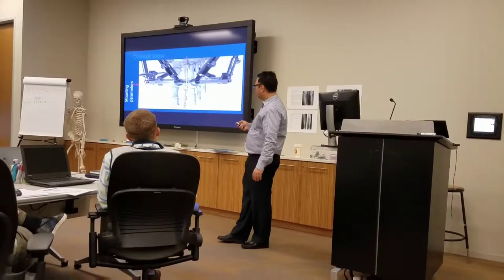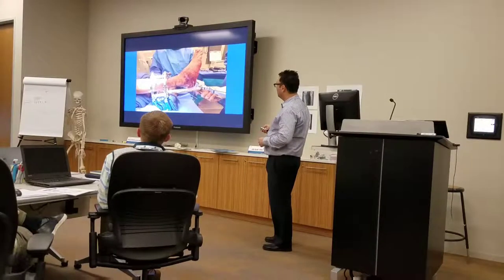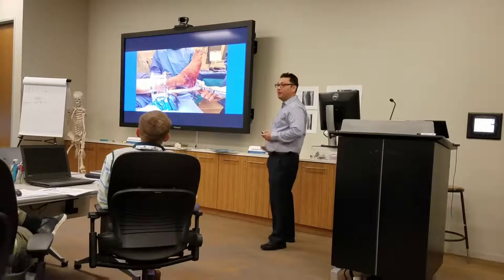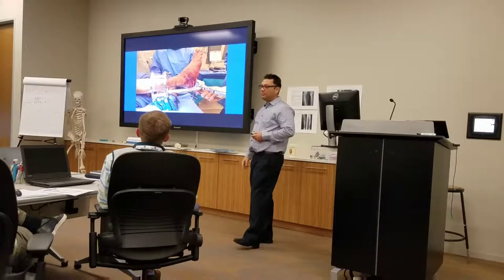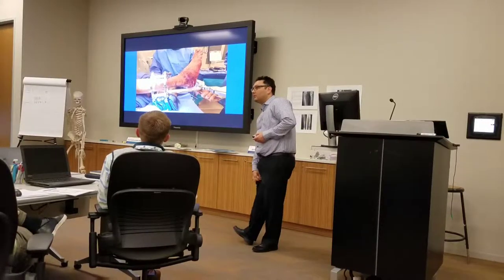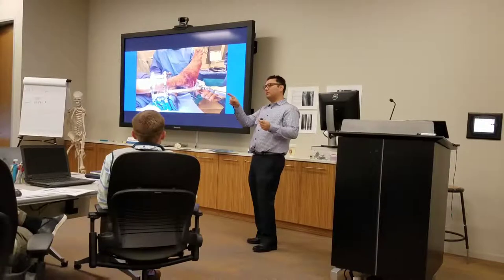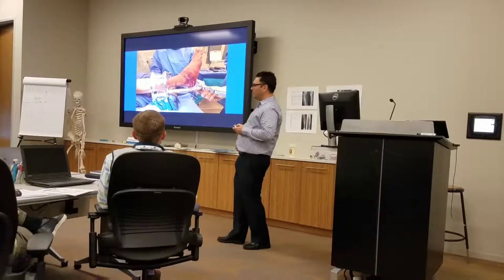I think that's wrong. Can I ask a quick question? On the previous slide, just out of my own curiosity, you were using a 5-hole post? Yes, I use a block post around there, yes. Okay. Is there a specific thought process on that? You can use anything. I find it more stable than using threaded rods, but you can use threaded rods. You can use many kinds of constructs. Less fiddle factor. This slips on really easy, and you're just throwing in the nuts, as opposed to the threaded rods where you're spinning the nuts. Right. I just find that it's the Al Thompson technique.